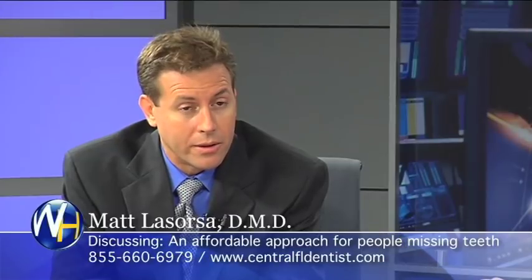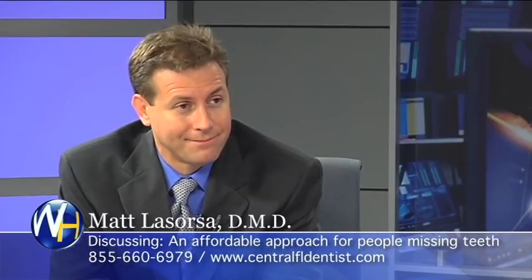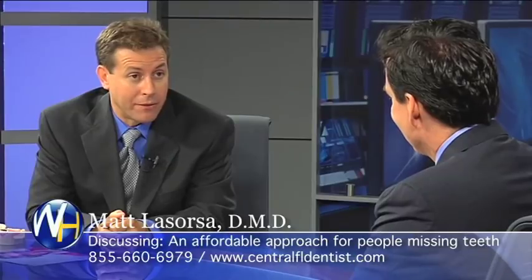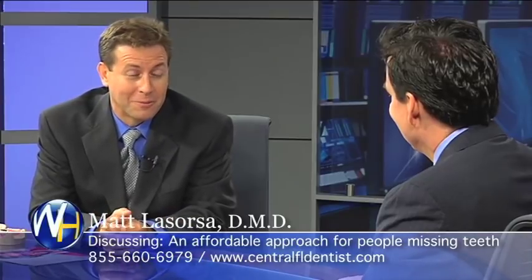Interesting. So the bone just grabs onto these implants? The mini implants are held in by the torque of the screw. So it's like screwed into the bone? Yes. Oh, so they're ready to go right then and there. They're immediately loaded, yes. Does that worry you a little bit, that they're out eating steak after the procedure? No, not at all. That's what I want them to do. Now, I'm not offering to pay for everybody's steak dinner, but he put me up to the challenge that day, so I had to. And it worked out.